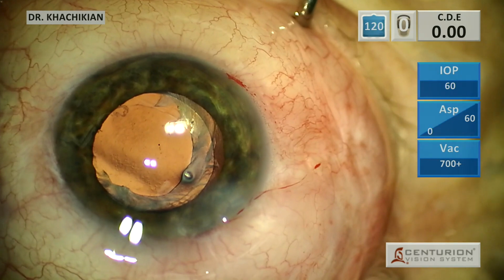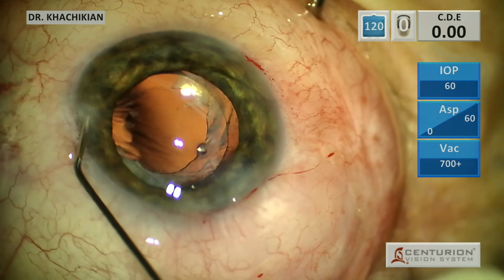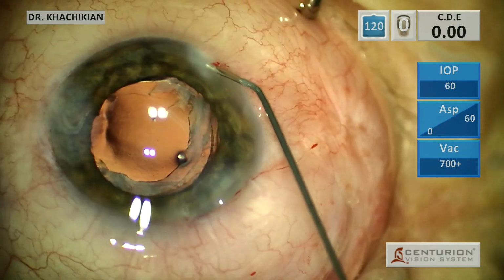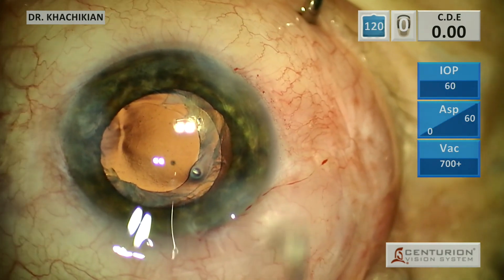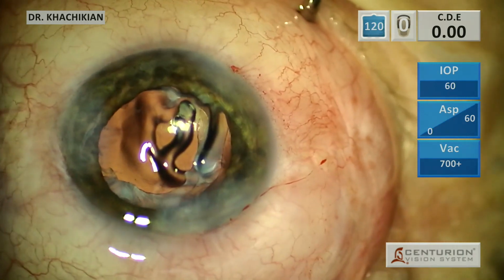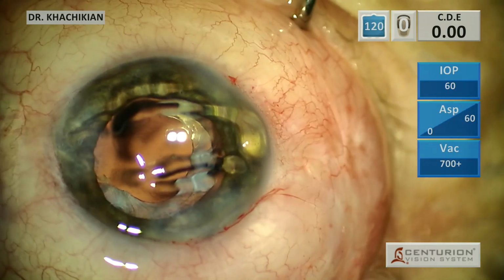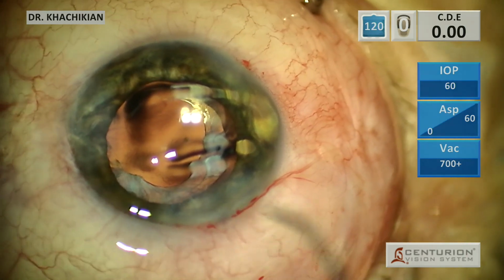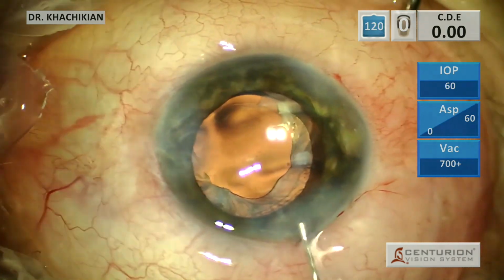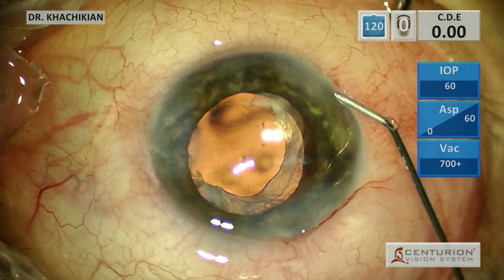Looking to see, using BSS to push back the iris to see what might be in avoidance there. You'll notice you can't really see the capsular tension ring in the periphery, which means it's pretty far out in the periphery. And that was viscoed on there. There we go. Clean that up. I always put viscoat on the cornea to prevent the cornea from drying out during the case. I think it makes a huge difference.